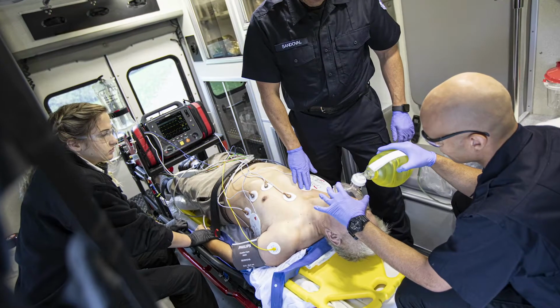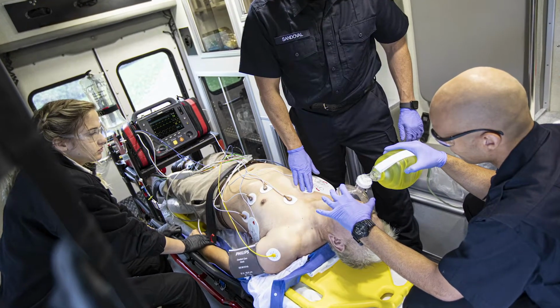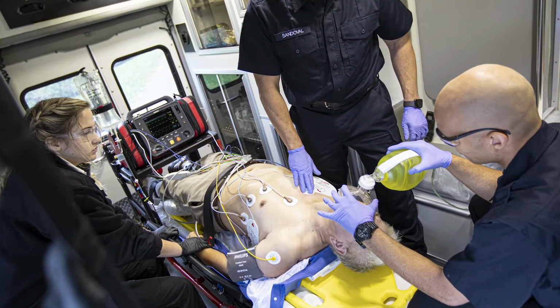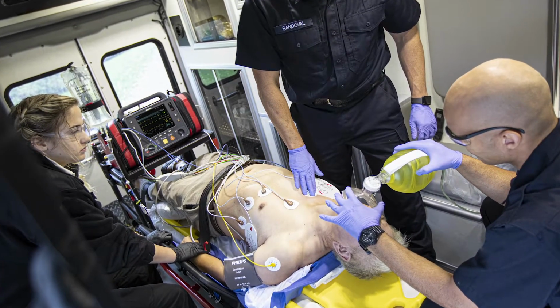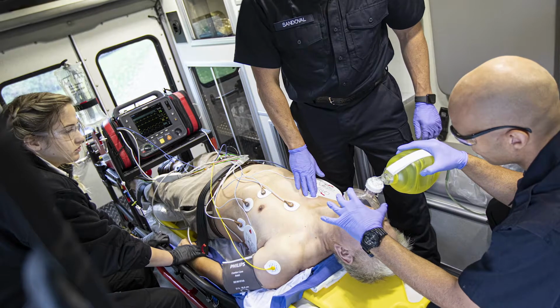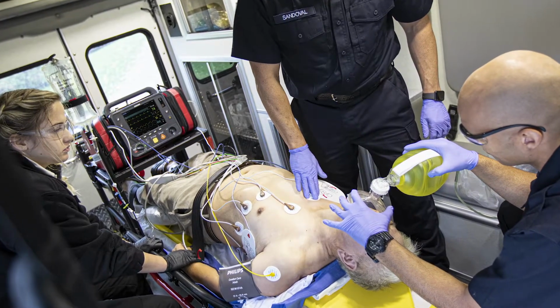The HeartStart Intrepid offers an optional 12-lead ECG function using the Philips DXL 12-lead algorithm that is available in monitor mode and allows you to preview, acquire, print, copy, and store a 12-lead ECG.